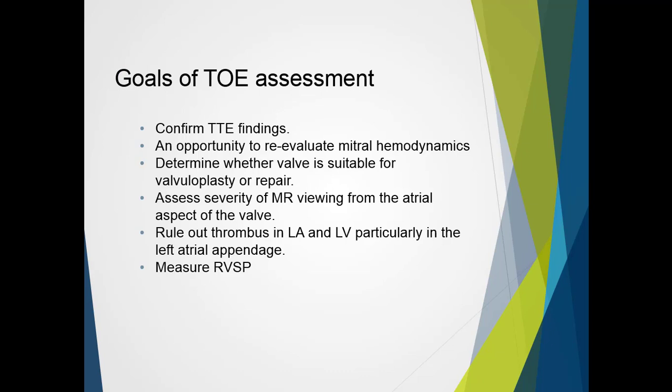Transesophageal echo is useful in confirming transthoracic findings, providing high-quality images of the valve. The study provides another opportunity to evaluate mitral valve hemodynamics to provide confident diagnostic information. Studies are often used to determine whether the valve is suitable for valvuloplasty or repair as alternatives to replacement. We can assess the severity of mitral regurgitation viewing from the atrial aspect of the valve, which is useful if there is significant calcification or prosthetic valves. This modality is best used to rule out thrombus in the left atrium and left atrial appendage — particularly in atrial fibrillation — as this is the standard view obtained before cardioversion, to avoid dislodging clot that could cause a stroke.